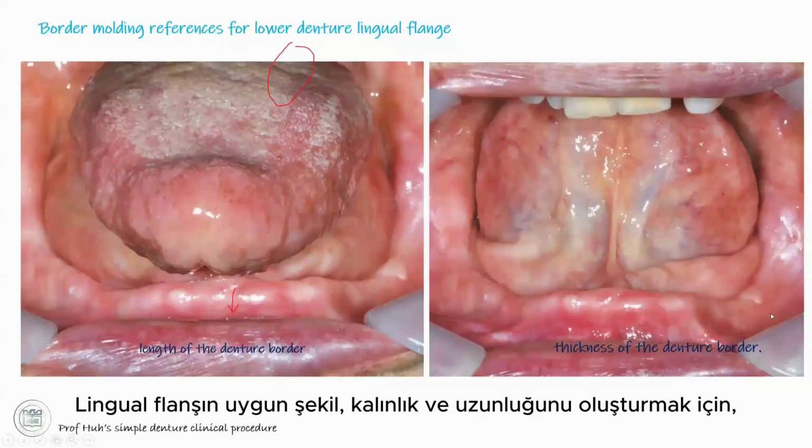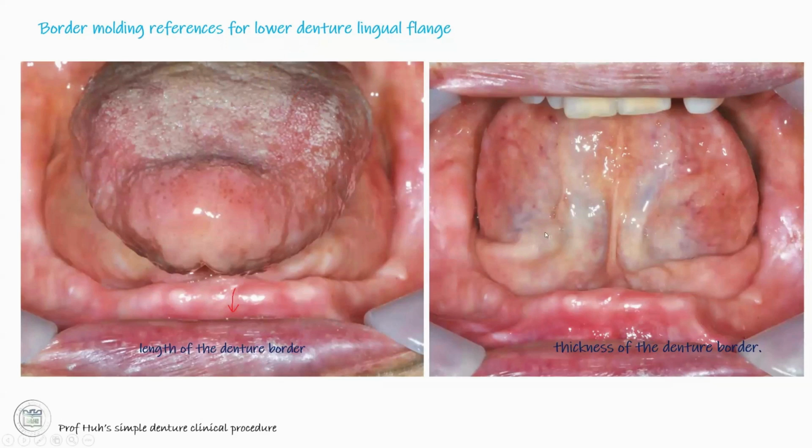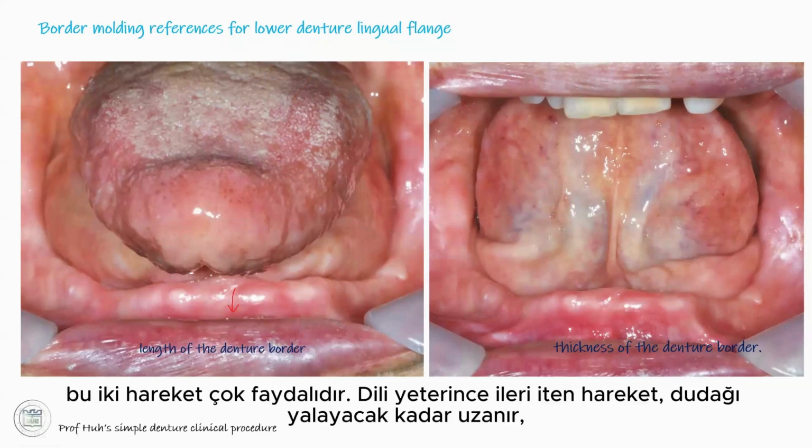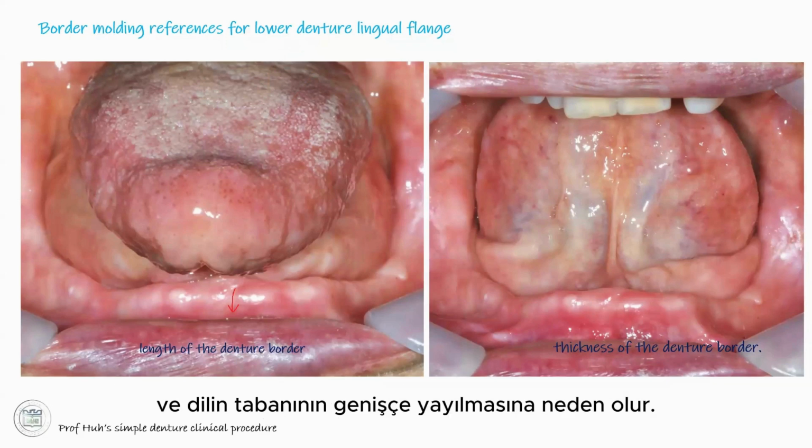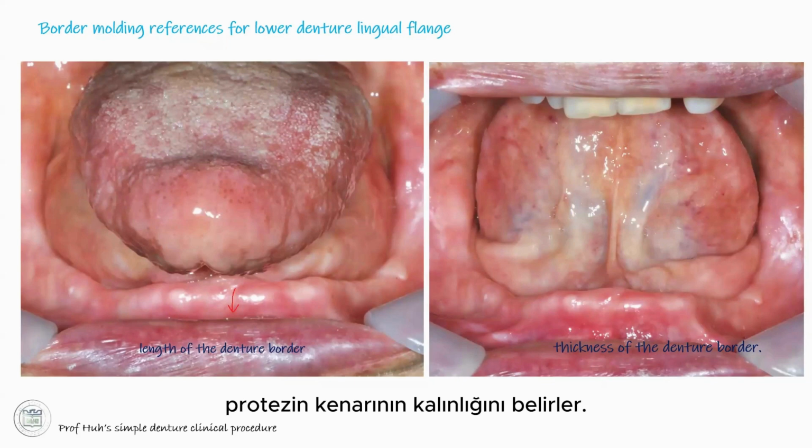Okay, to make a proper thickness and length of the lingual flange, these two motions are very useful. The forward movement of the tongue, which extends enough to lick the lip, determines the length of the denture border. The upward movement of the tongue, which strongly presses against the anterior palate and causes the base of the tongue to spread widely, lets you determine the thickness of the denture border.